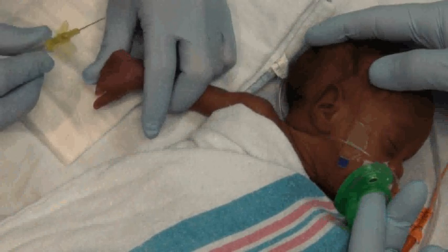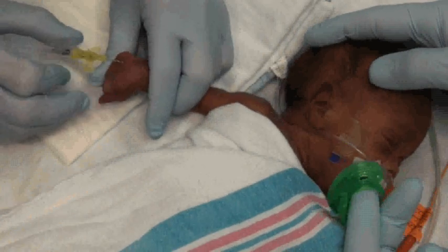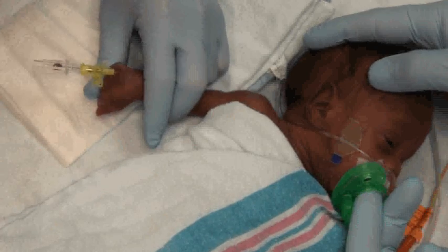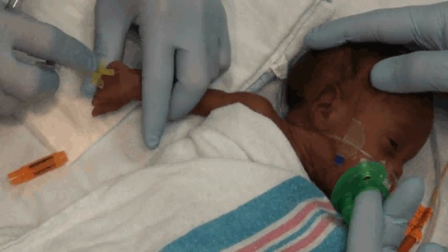Once the area is sterilized, a 24-gauge angiocatheter is introduced into the vessel. The stylet is removed and blood is allowed to flow freely.